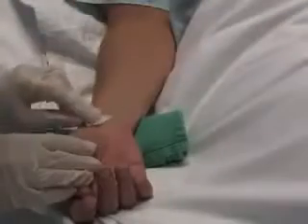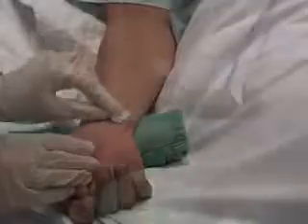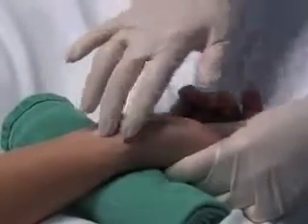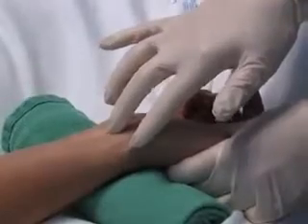Clean the site with an alcohol swab. Palpate the radial pulse and determine the point of maximum impulse, or use the Doppler ultrasound device to identify the location of the radial artery.